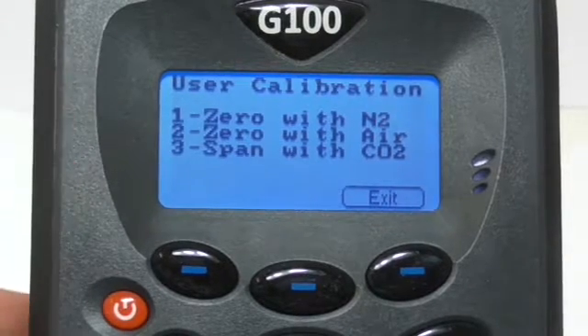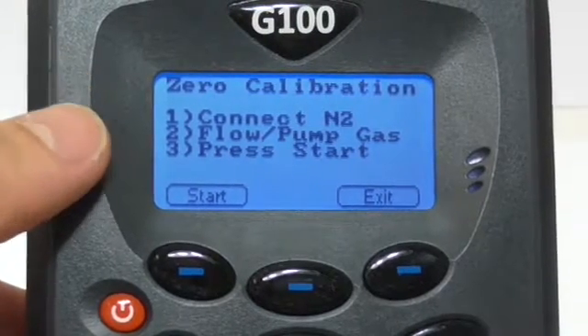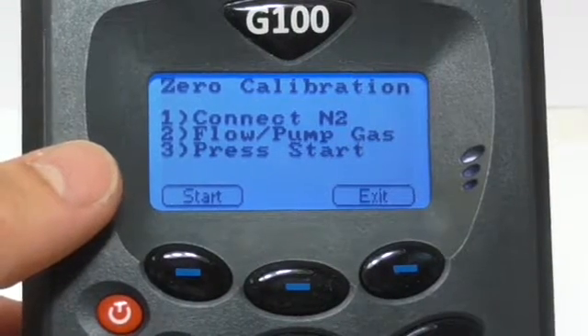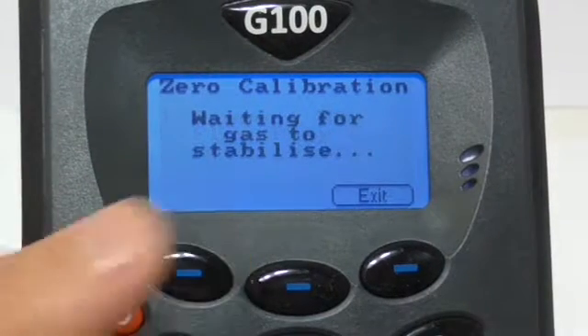Press key 1 for 0 with N2 and follow the instructions. Connect your nitrogen to the inlet port and start flowing gas. I would recommend leaving it for approximately 3 minutes before pressing start, as this will give you a more accurate zero calibration.